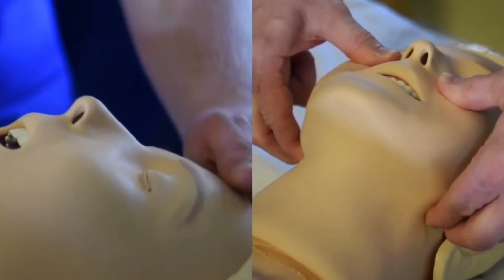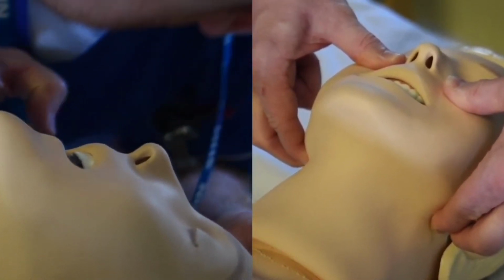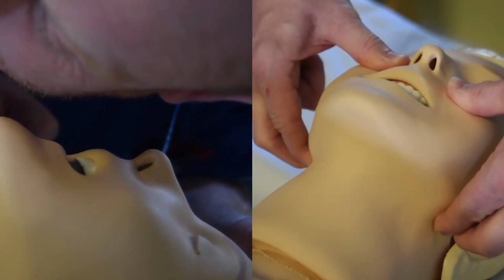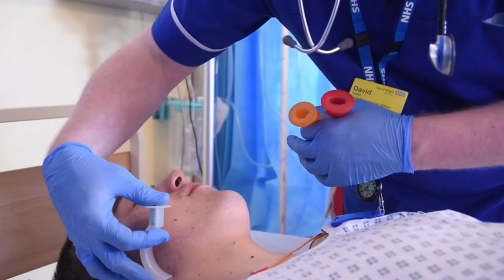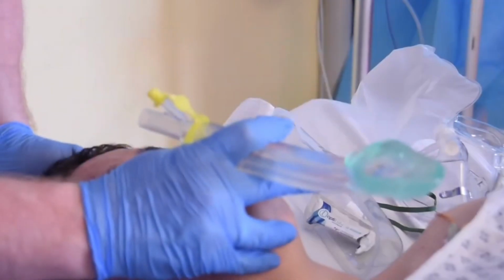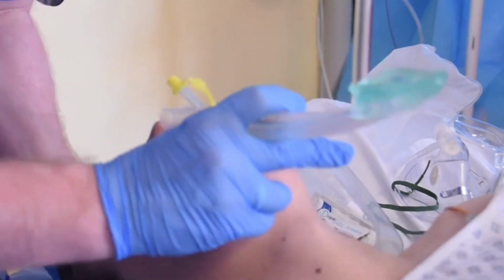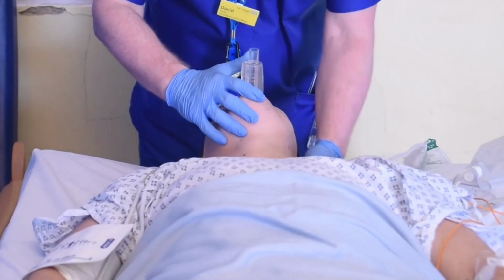These maneuvers both provide excellent airway opening, but can be supplemented with airway adjuncts depending on the skills and experience of the practitioners and the condition of the patient. Safe use of simple adjuncts like oro or nasopharyngeal airways, or advanced airway adjuncts like an i-gel device, may help improve patency and stability of the airway.